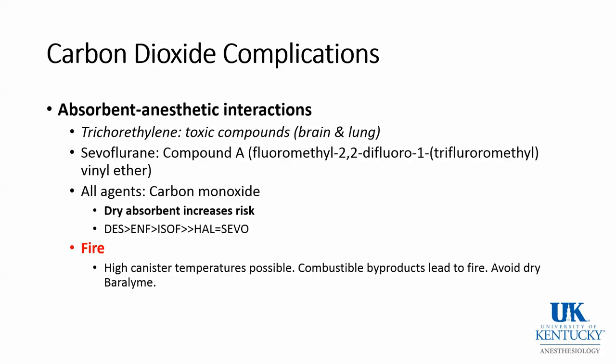The order of carbon monoxide risk appears to be desflurane, enflurane, isoflurane, halothane. You may or may not have seen videos of fires occurring on anesthesia machines, which are related to high canister temperatures. They are relatively rare. We have had nothing like this at University of Kentucky, to my knowledge.